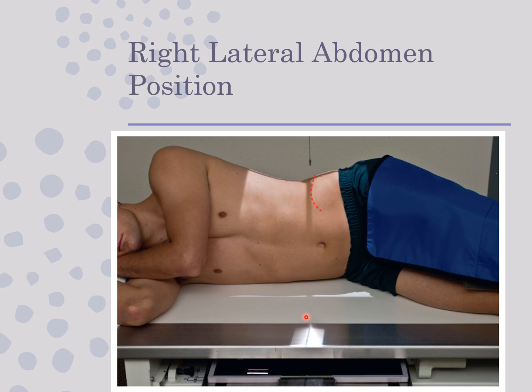So 80 at 25. The central ray on this should be perpendicular, and it's at 2 inches above the iliac crest. Now, how do I know that? Even though the book is showing you incorrectly, along with this slide on the PowerPoint, notice under the anatomy, the very first thing it says is diaphragm and as much of the lower abdomen as possible.